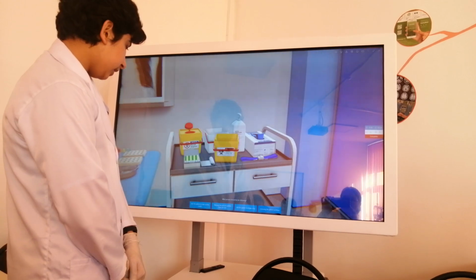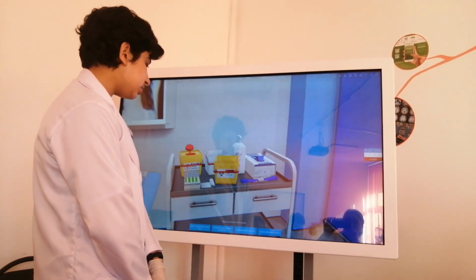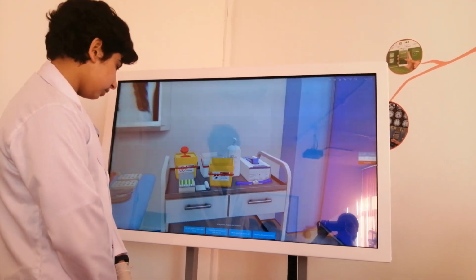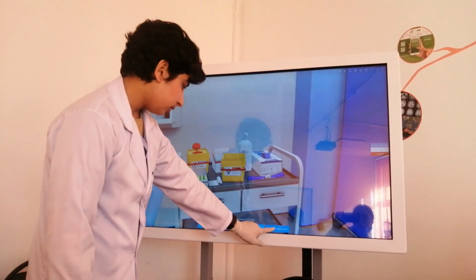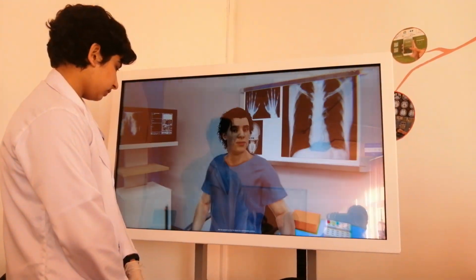Ask the patient to take a deep breath. Remove the vacuum system from the vein. Ask the patient to make a fist. Choosing the patient position: ask the patient to sit or lie down in a comfortable position.